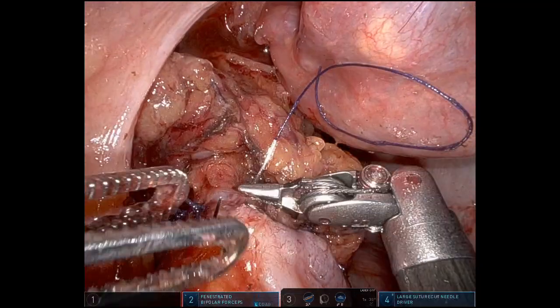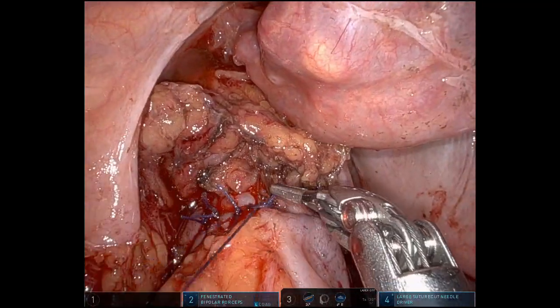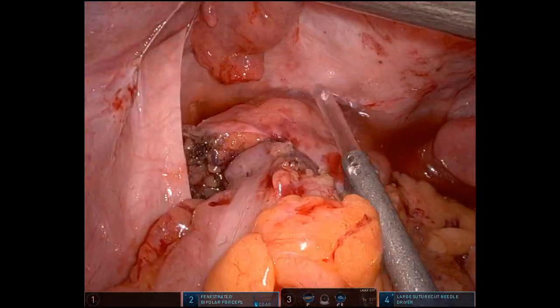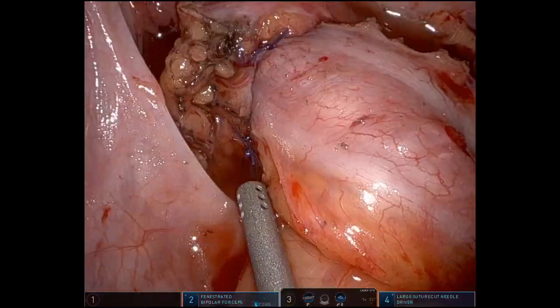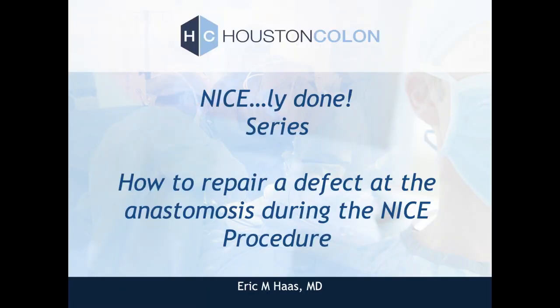This is suture number four. Following this, basically that's it. No need to divert, no need to do anything different than you would do. When you repair it like this, it's as good as new. We're doing our air insufflation test, taking special attention to focus on that area where those four sutures were. We see no bubbles, no leaks, and it looks very good.